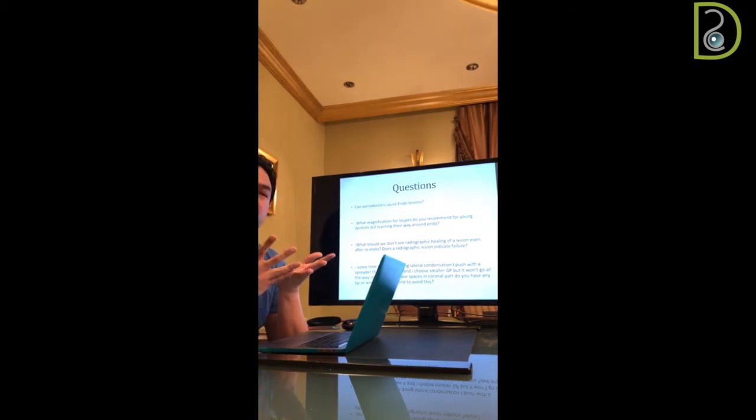Of course, if you have a microscope, it's better. If you don't have one, usually you have to use loupes. And I recommend using custom loupes because we have 2 types, either customized to your eyes only for you or universal that everyone can use. So I recommend custom made loupes, especially for you, to have more accuracy and more benefit from using these loupes.